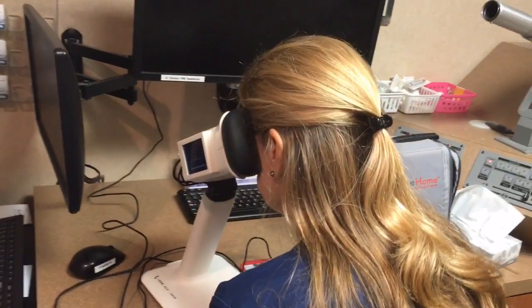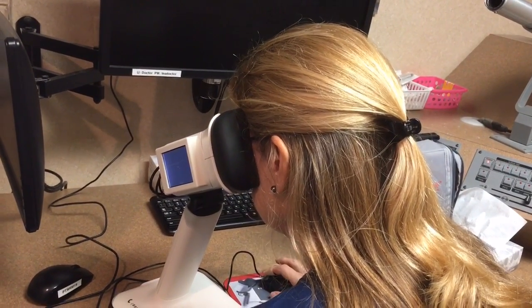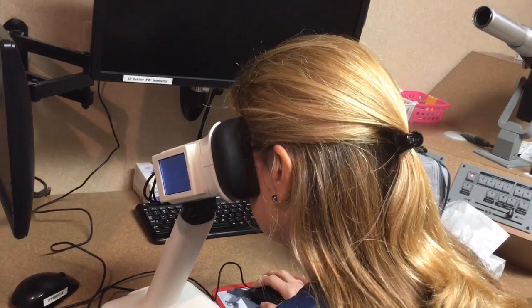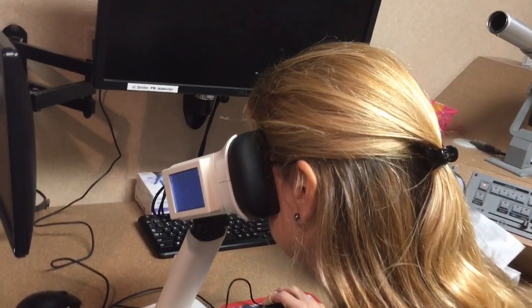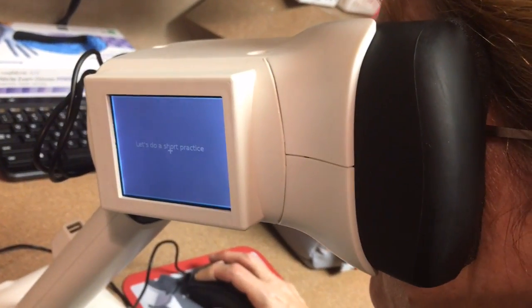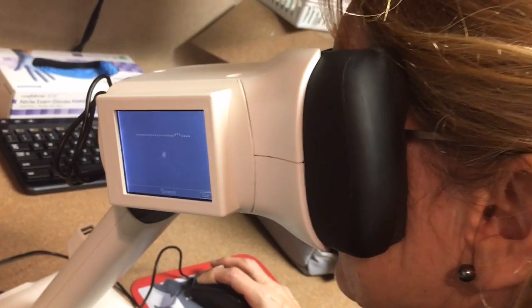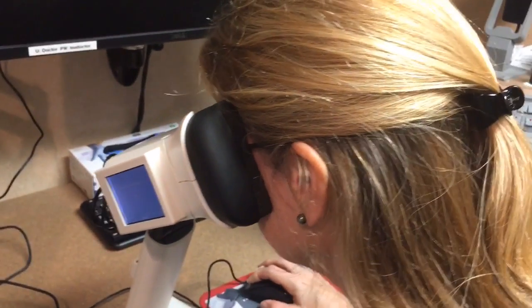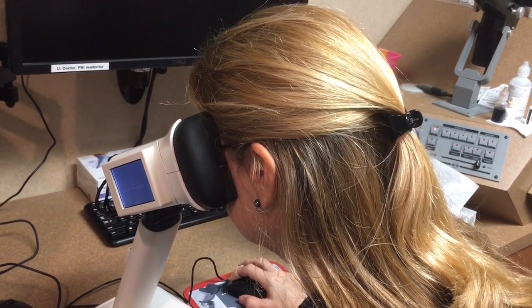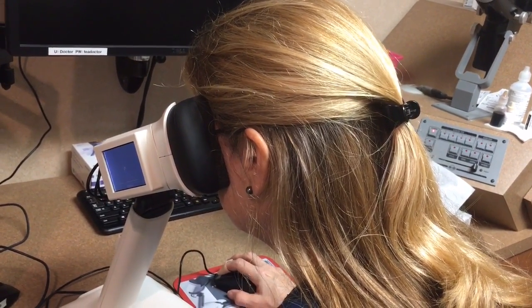It's kind of explaining instructions on how it works, and showing Peggy how to mark it. Basically, there's a center dot in the center — it's what we call a focus dot. What she does is she actually picks where she sees the wave. She hovers her cursor onto the wave and clicks with the mouse to where she thinks the wave is on that line, and then it goes back to the center point again, and she does it again.